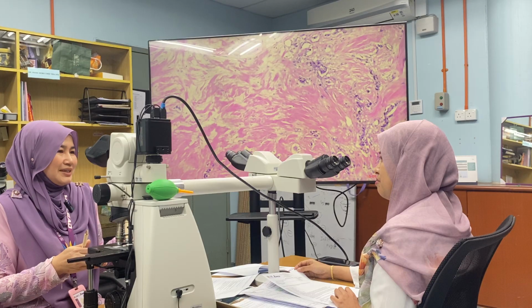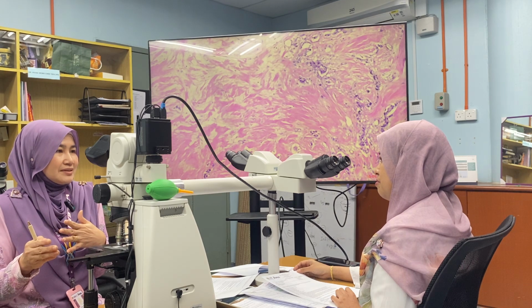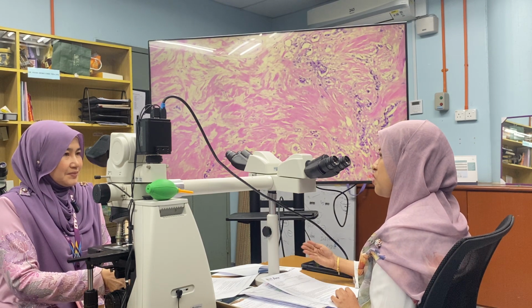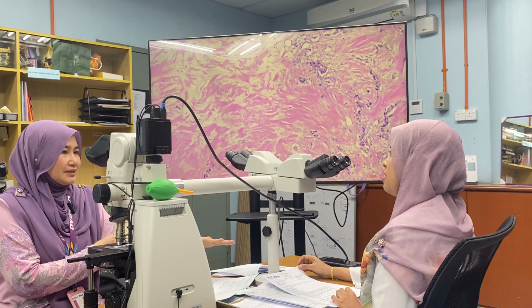Meaning that the pathology appearance post chemotherapy, is it only fibrosis? I think we have many other changes that lead to the pathological changes in the pathologic appearance due to chemo. Is it on gross specimen or microscopic? Gross, as well as translated to microscopic.